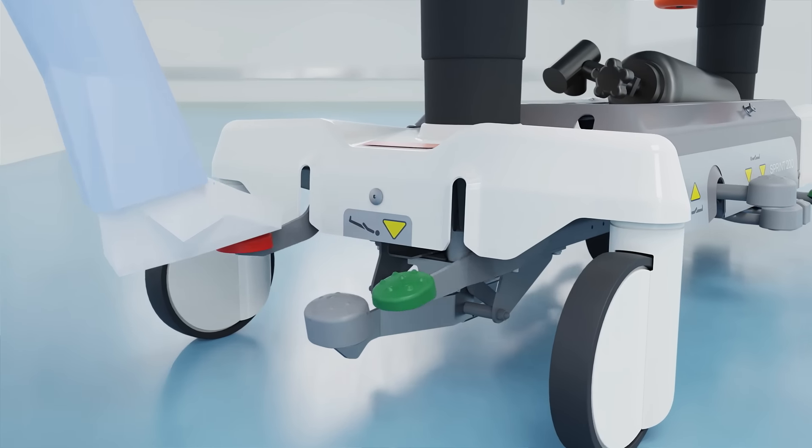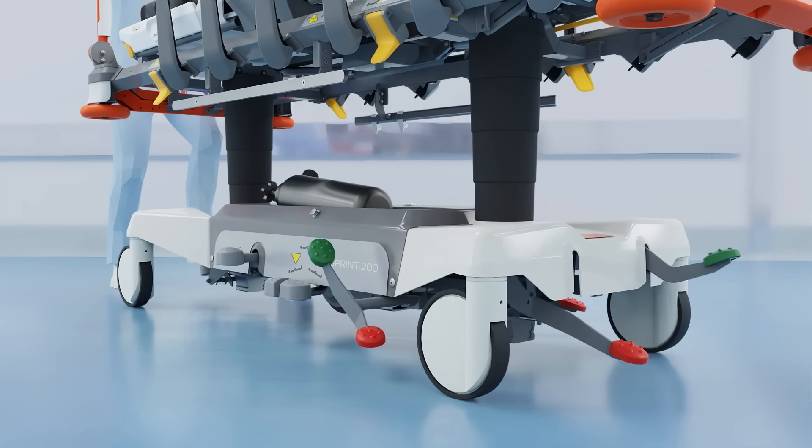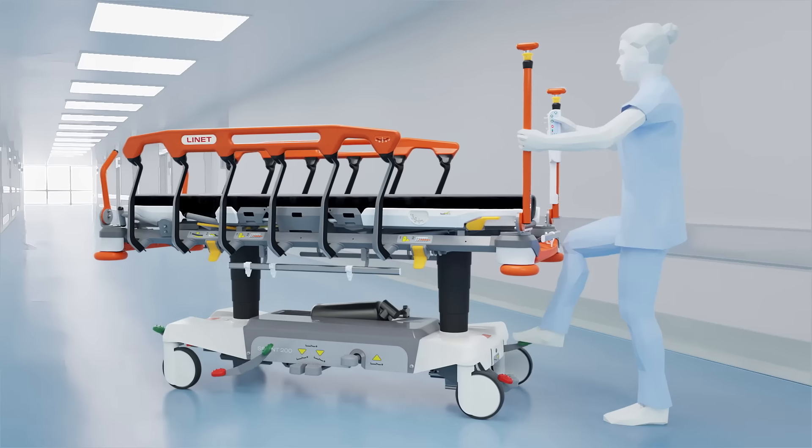To improve braking and steering, easy brakes are always visible and can be reached from all four sides.